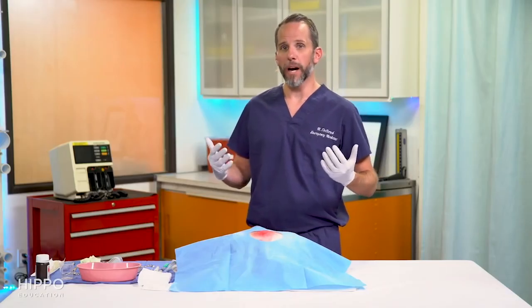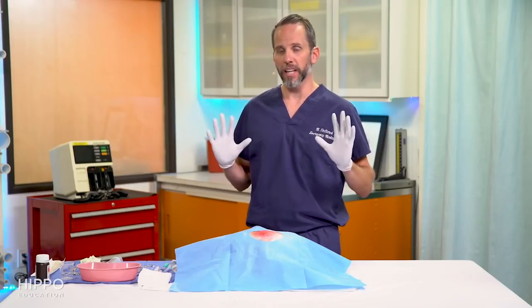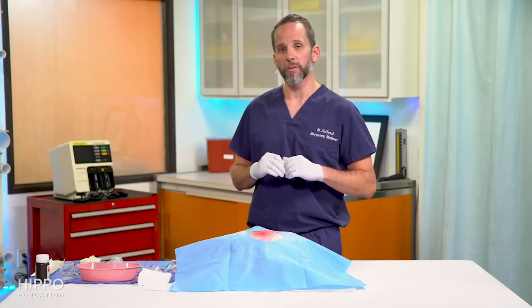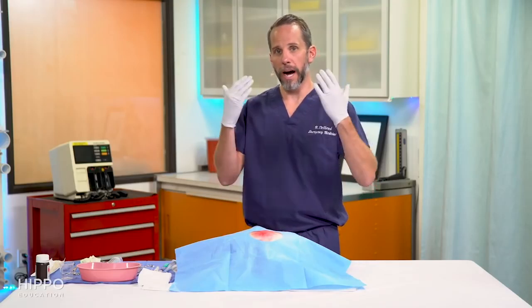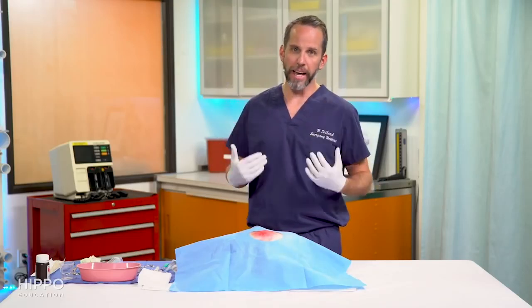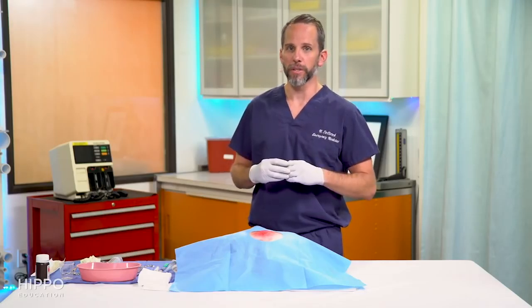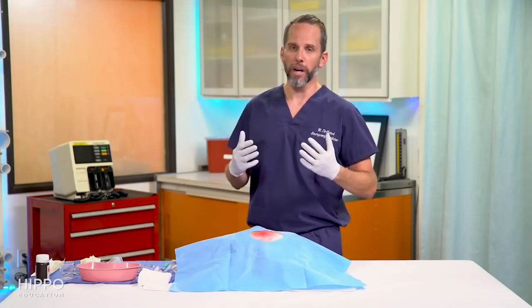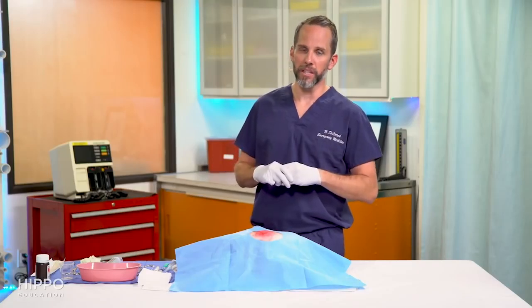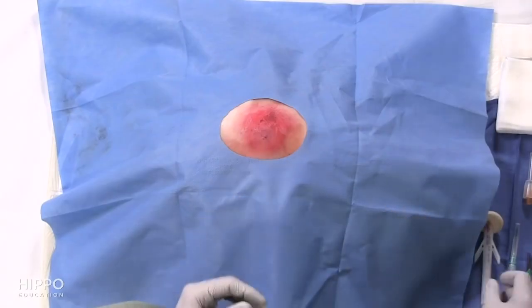Just of note, I'm not wearing any personal protective equipment for this other than gloves. If this was a real patient with purulent material, I would be wearing eye protection, a mask to protect my mouth, and a gown — because there's nothing worse than getting pus on your nice scrubs. PPE is definitely important.